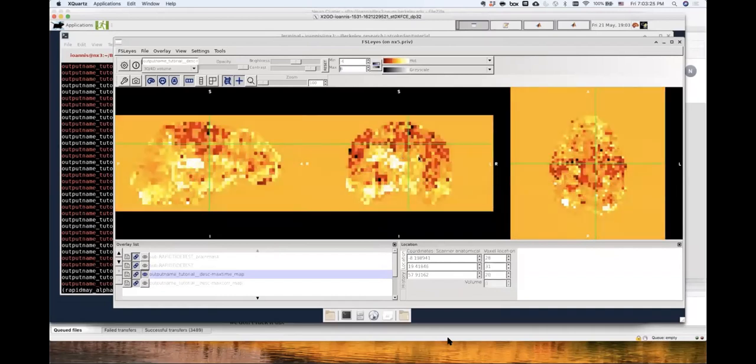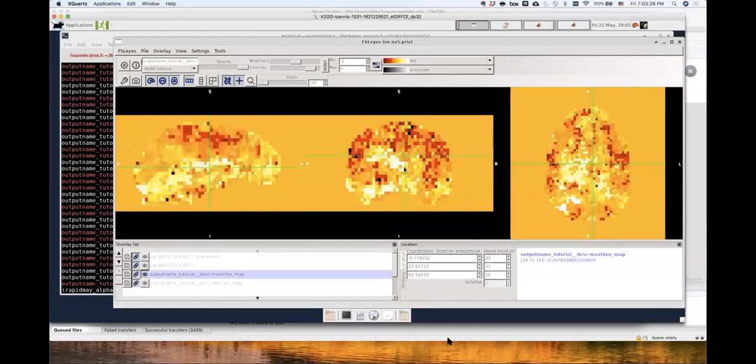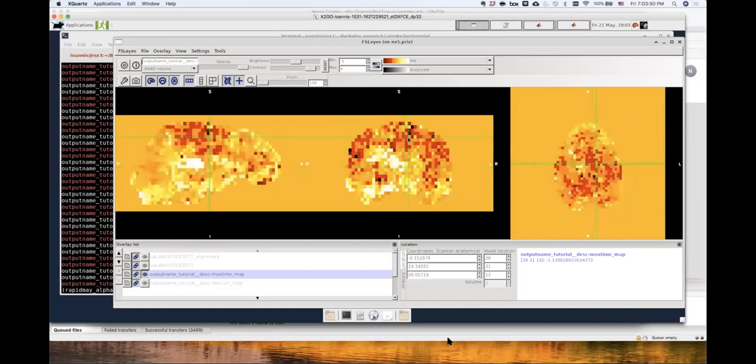This is a 3D NIfTI file where one can see the lag times. These are the times for each voxel at which the cross correlation with your refined regressor is maximal. You can see here that, for example, this voxel has a lag time of 4 seconds compared to other voxels. For example, this voxel has a lag time of -1, so it's ahead of the regressor.